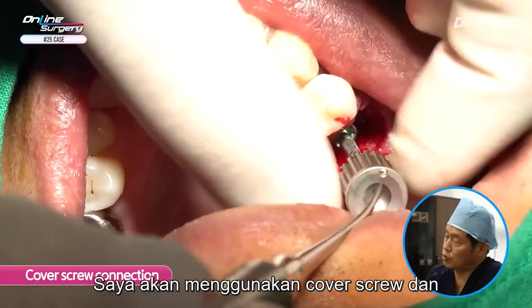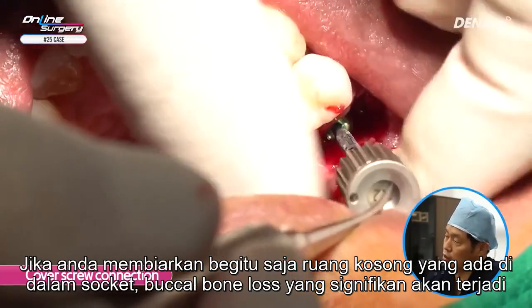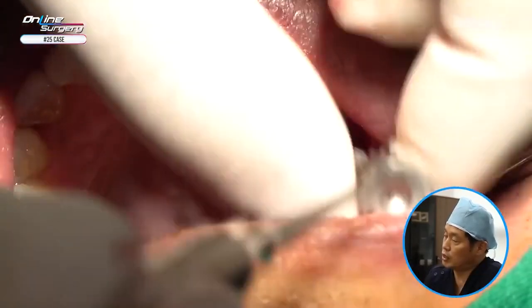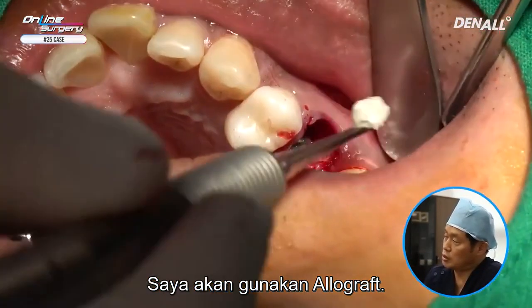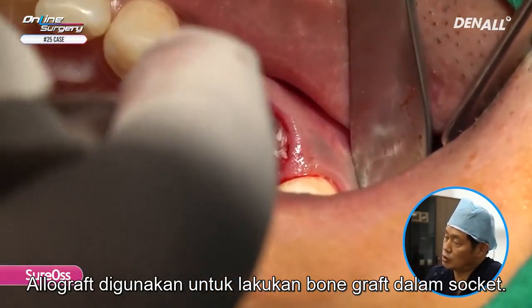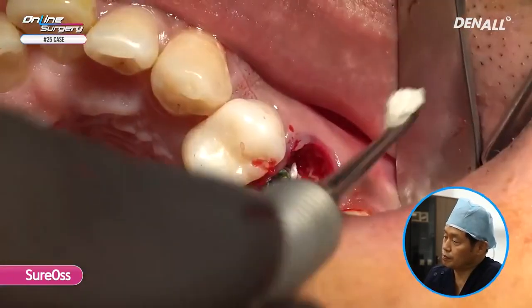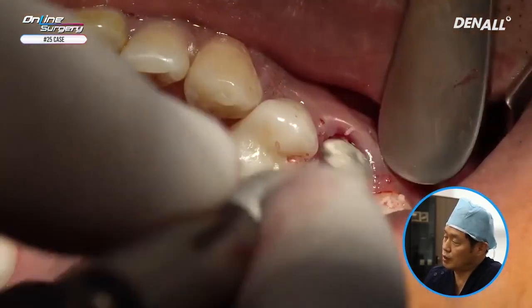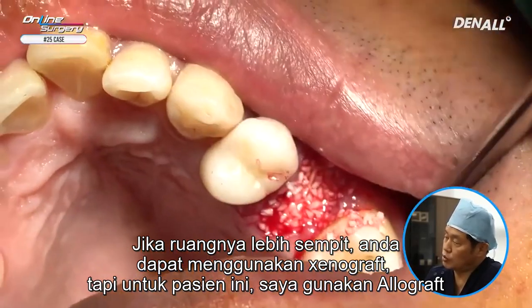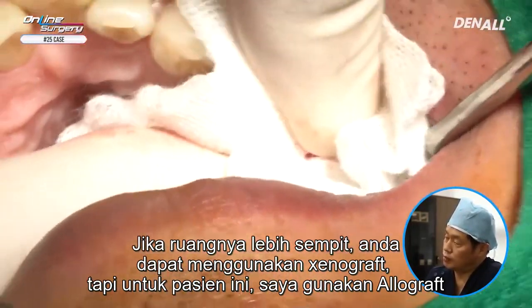I'm going to use cover screw, and for the empty space within the socket, if you just leave it as is, buccal bone loss can occur significantly. I'm going to use allograft. There's more than 2 millimeter of space here. Allograft is used to do bone graft within the socket. If the space was narrower, you can use a xenograft, but for this patient, I'm going to use allograft.